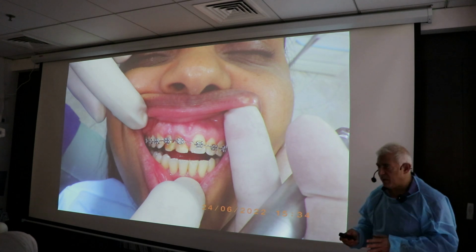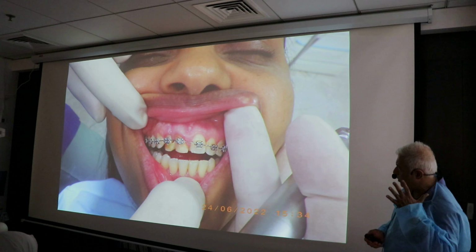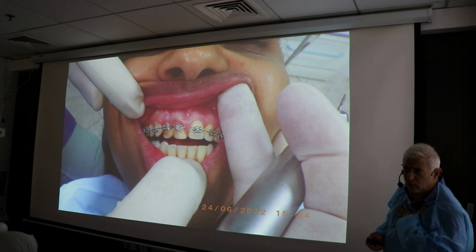So this is the time of surgery now. Based on my periapical, I think I'm okay to take the risk. Now, my plan is what now? What is my plan?